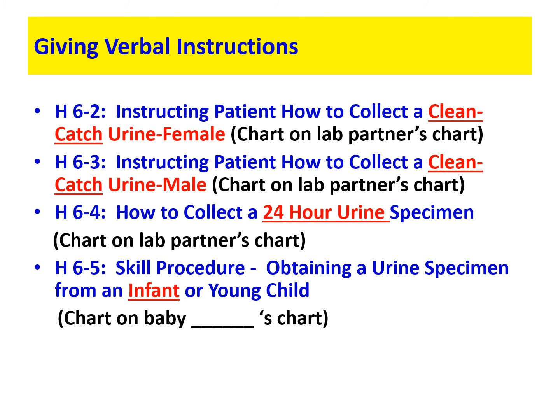It has a little sticky area on it, and you pull the labeling of the little binder off of that, and it reveals the sticky part. And then you place it over the genital area where the urinary meatus, where the urine comes out of either the male or the female infant. And then you just stick it onto their skin, and then you put their diaper back on. And then you can go see another patient, and you wait.